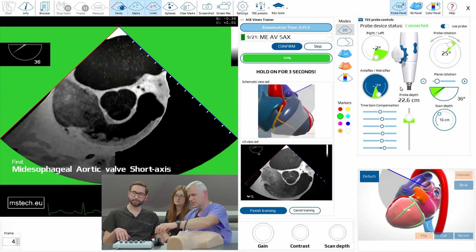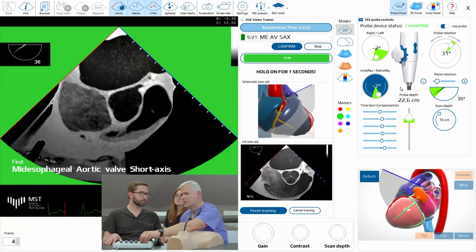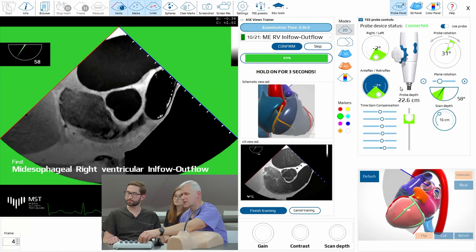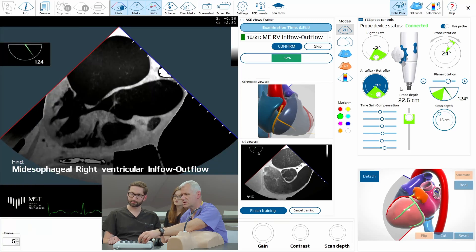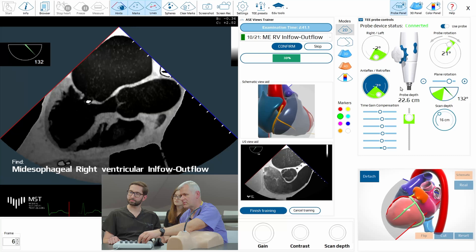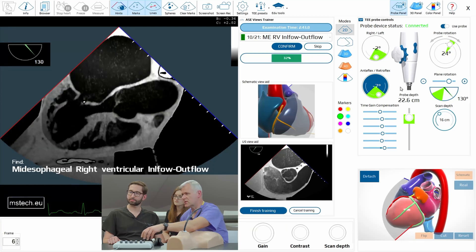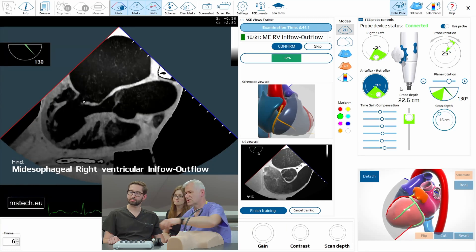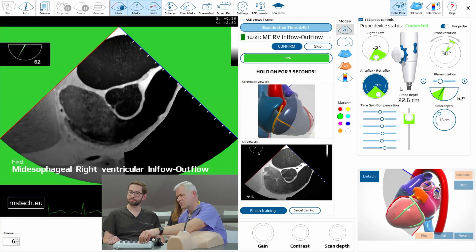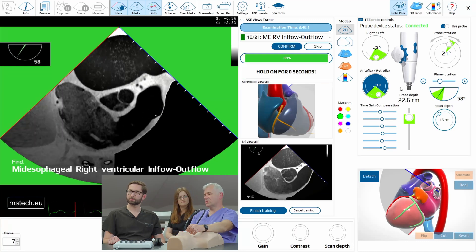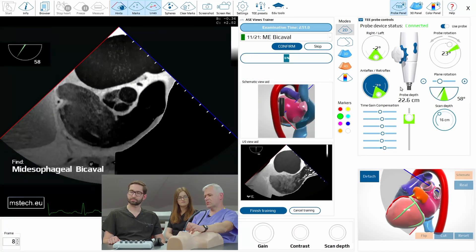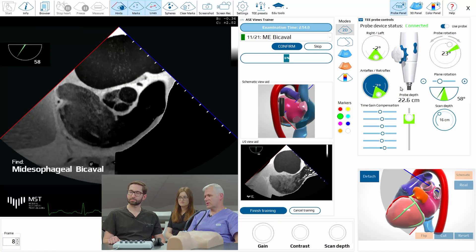The order of the views is slightly different. The order is according to the American Society of Echo, which is great. I think it's a good order, but from some point of view it's good to slightly modify it to learn quicker.